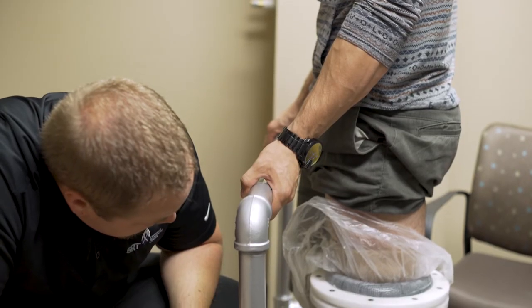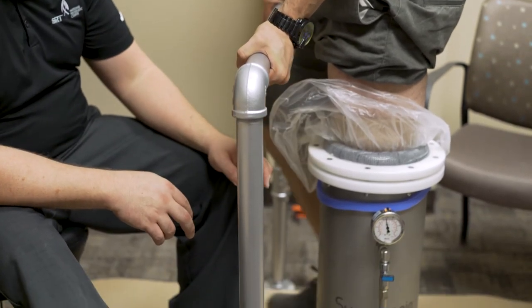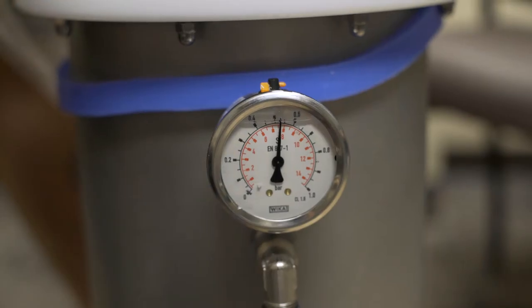The unit is now completely filled and the valve is closed. The patient can begin to transfer all of their weight onto the Symphony Aqua system, supporting themselves in the parallel bars, walker, or back-up chair as needed. The ultimate goal is to bear as much weight as possible through the residual limb into the system. The patient's limb should enter at the level of the femoral condyles or to the top of the patella — penetrating too deep into the cylinder will diminish the desired pressure.